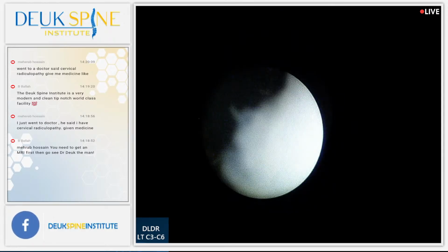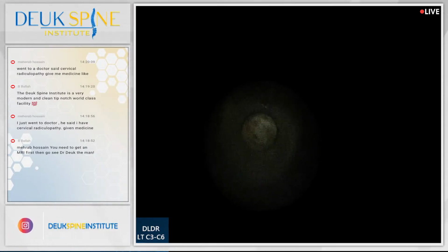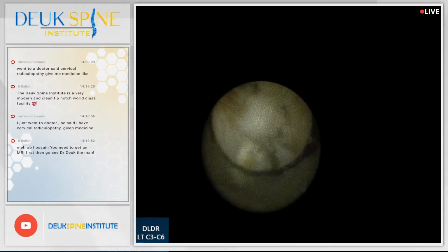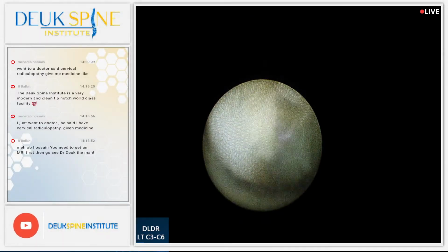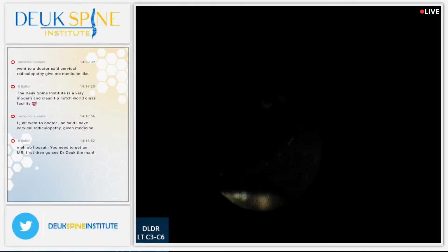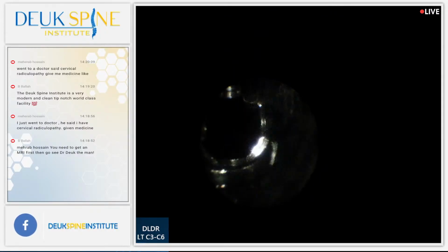Sam. Yeah, flip. I don't know. All I know is I'm struggling to get the pieces up and out. And the laser is just, I need more power on the laser. The suction's not the issue right now, it's really the irrigation.